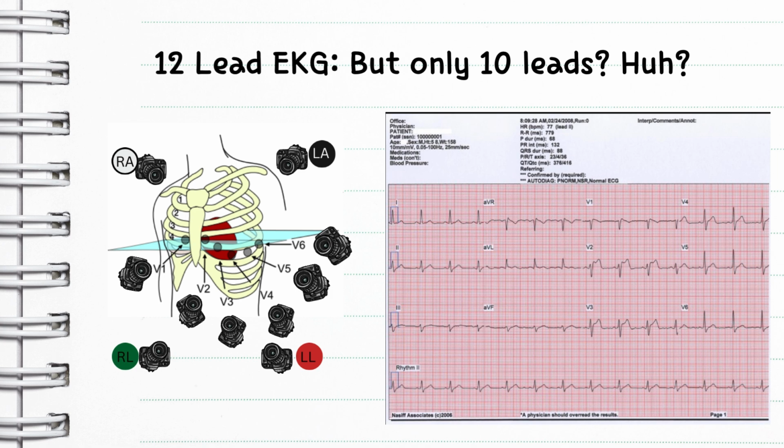So basically how this works is when you're performing a 12-lead ECG, you place 10 electrodes on the patient's body. There's going to be 4 on limbs, so your right arm, left arm, right leg, left leg. Okay. And then there's going to be 6 electrodes placed on the chest. Now, do sometimes people place those limb leads on the chest and lower abdomen? Yes. Are they supposed to be on the arms and legs? Yes. But can you still do it on the chest and upper clavicle area, not on top of a bone? Technically, yes. But it's better if they're on the limbs. Okay. So the 10 electrodes work together to create 12 different leads or views of the heart's electrical activity.